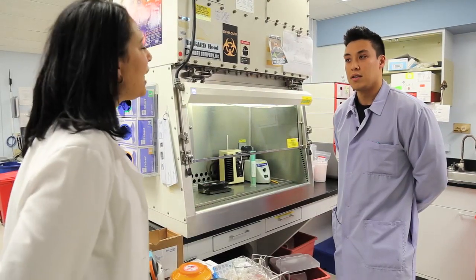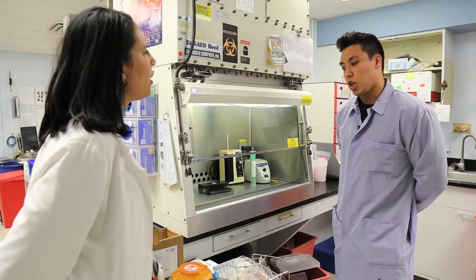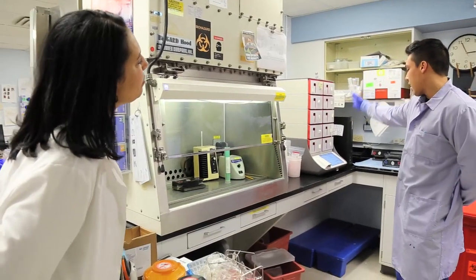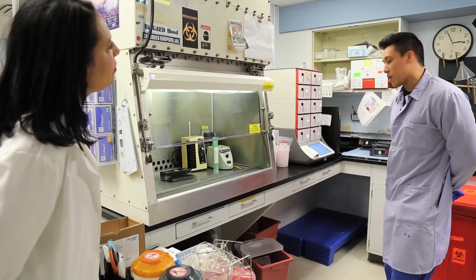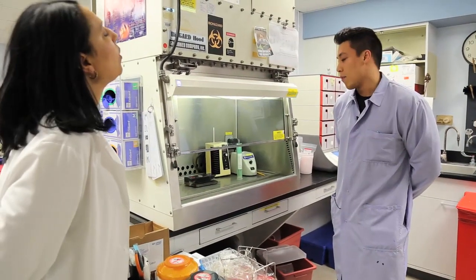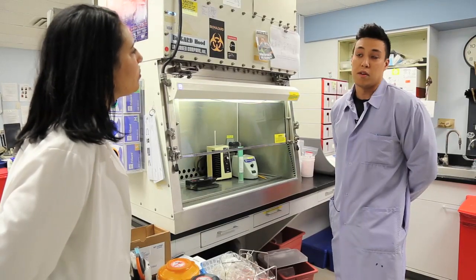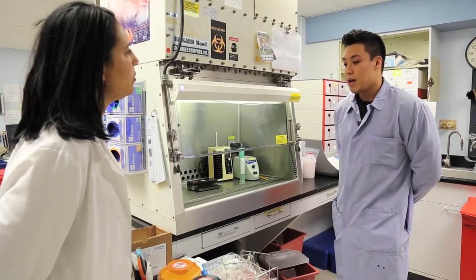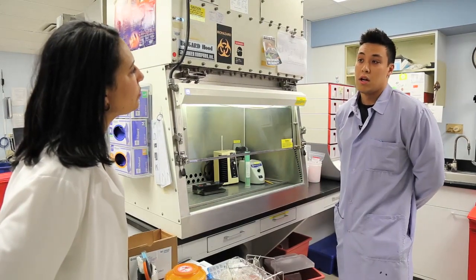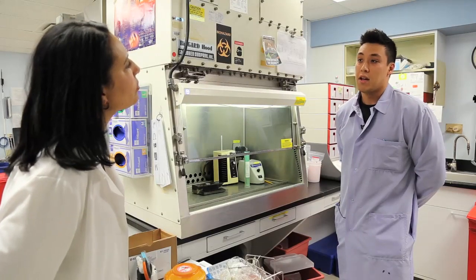Okay, so how many can you run at a time, or how often do you batch them? Sure. If you look here at our instrument, we have 10 slots. Technically we can run 10 at a time. Each slot is specific for one specimen at a time, and we try not to batch the specimens. This is a PCR method, meaning we can run this test and get the results in a little over an hour. So we want to utilize the technology, and we do run those as a stat priority.